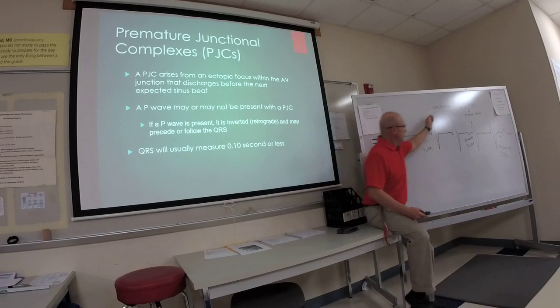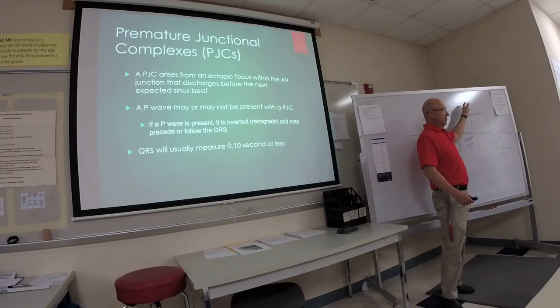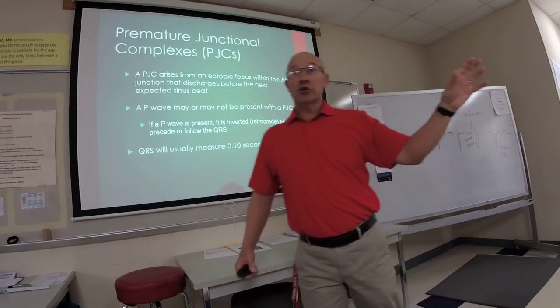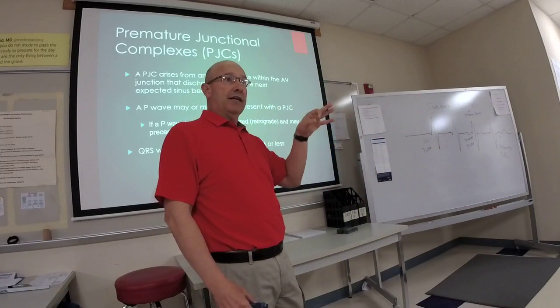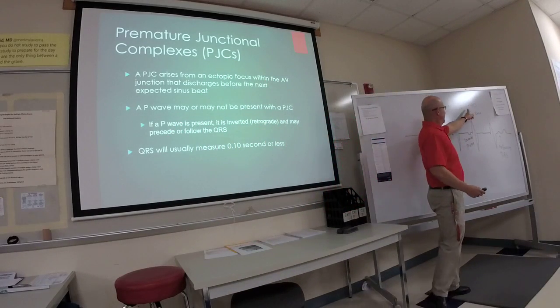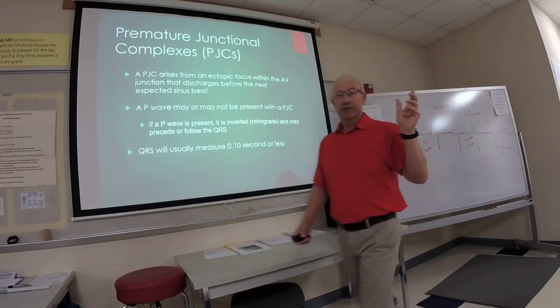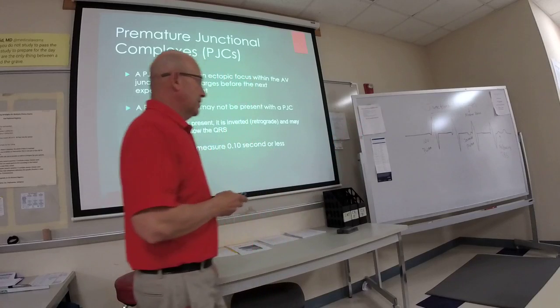expert drawing. A junctional rhythm, the normal rate is between 60, you could say 59, but 60 to 40, right in there. So a junctional rate is going to be slower. You could have a junctional tachycardia, which we'll look at in a minute. You could have a fast junctional rhythm, but the normal junctional rhythm is 40 to 60. It's abnormal because the SA node is not depolarizing. Something has happened to the SA node. Oh no, right?